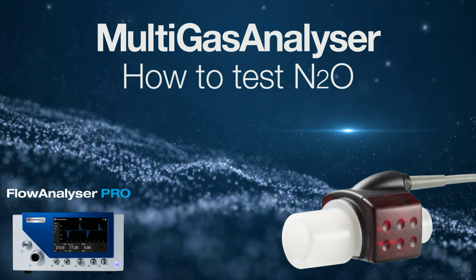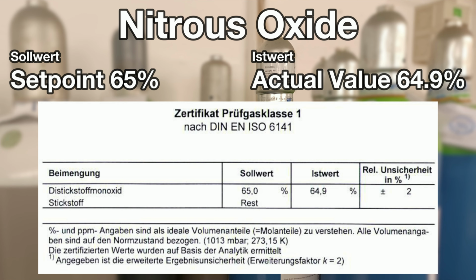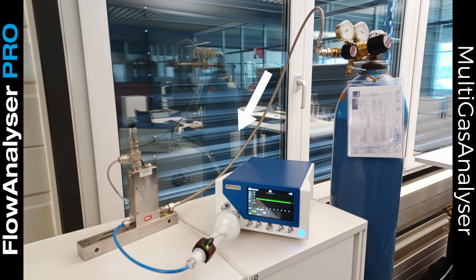MultiGasAnalyser. How to test nitrous oxide with the FlowAnalyser PRO. In the following example, the certificate for the used nitrous oxide gas shows a set point specified at 65% and an actual value of 64.9%. Here's a simple way to connect devices for nitrous oxide analysis.